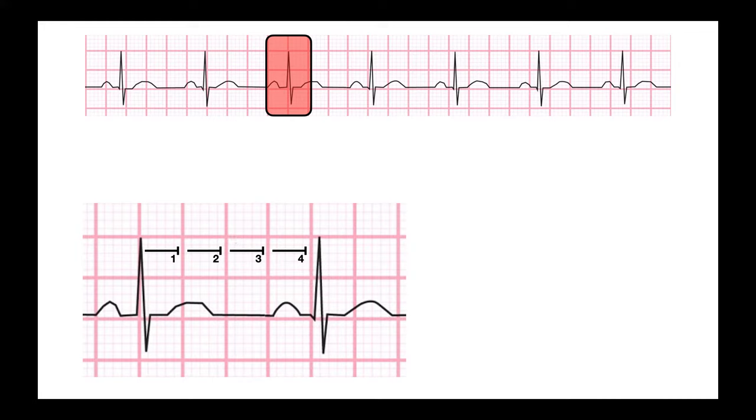This is the peak we're going to use. The first time you see this method it's going to seem a little bit strange. You have to do a little practice before it becomes more natural. The way this works is I start at that peak in question and every time I go a distance of a big box over it gets assigned a particular number. I start here, go one big box over and it gets the number 300.